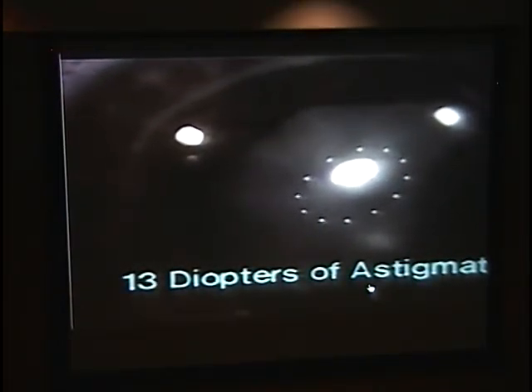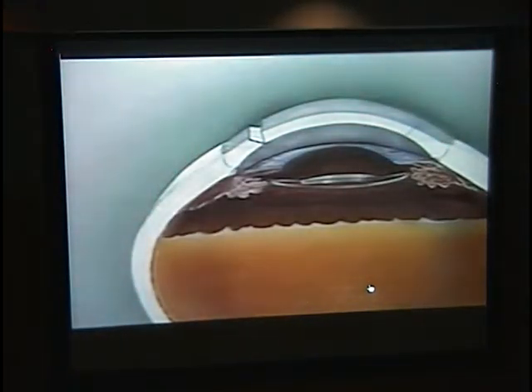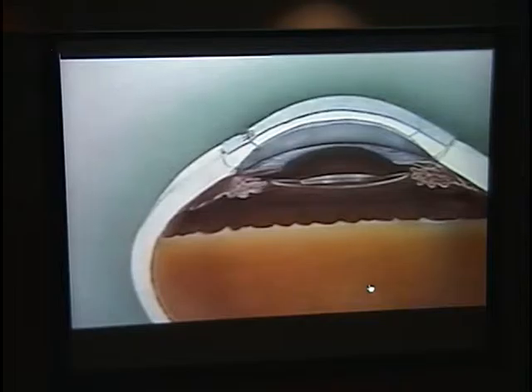an idea of tight, loose sutures, steep, flat meridian. It is not quantitative, and in my experience, no quantitative keratometer is truly quantitative intraoperatively during keratoplasty or wedge resection. When you use monofilament elastic sutures, the folding of the cornea at the resection area tends to accentuate the effect. So we are compressing at the wedge site, pulling the cornea together, making the flat meridian steeper.